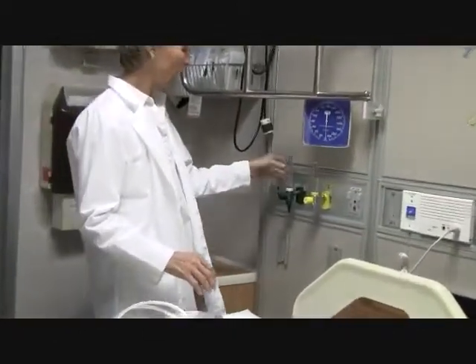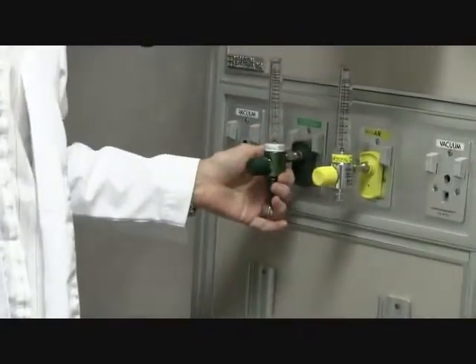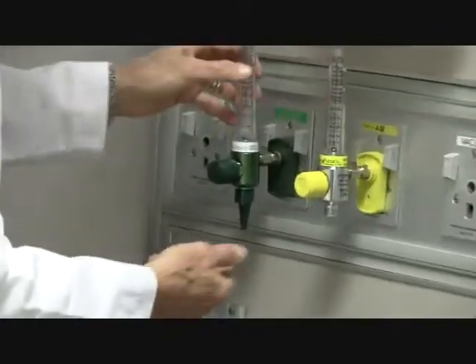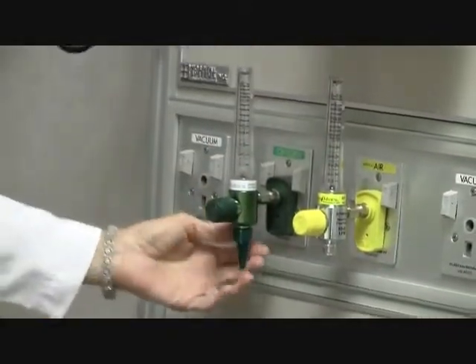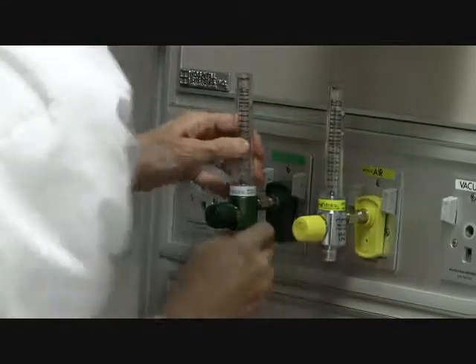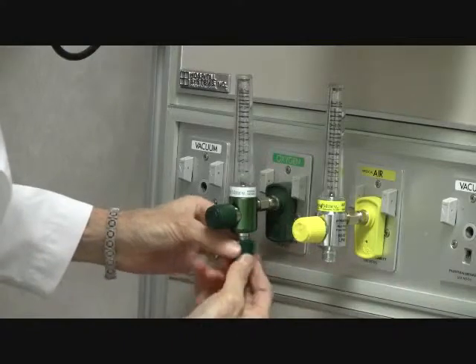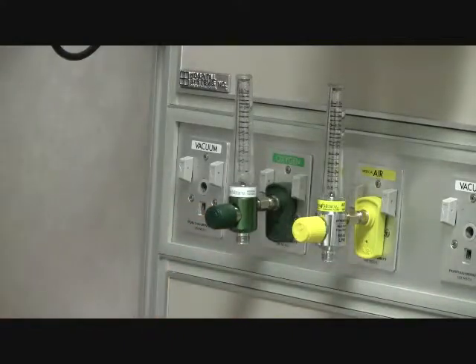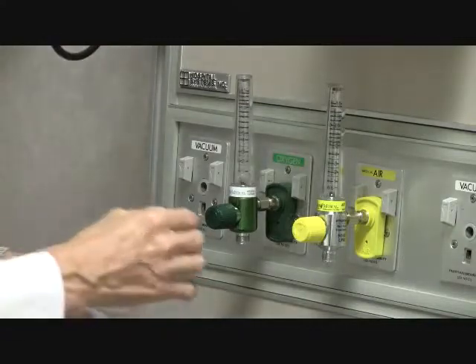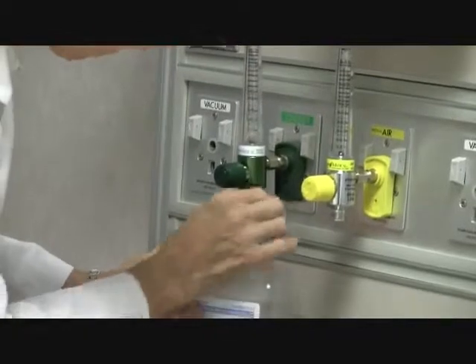And the way that you're going to set a humidifier to the oxygen is you're going to first come to your oxygen flow meter on the wall, and you're going to notice that in the hospital, this is pretty commonly called the Christmas tree. It's a little green device. You cannot have that on there when you're going to connect your bubble humidifier. You're just going to take the top, you're going to screw it onto your oxygen.